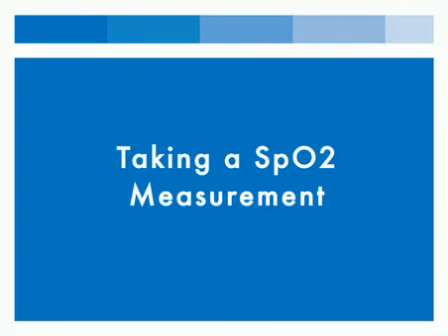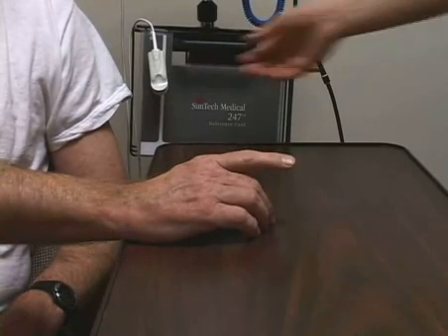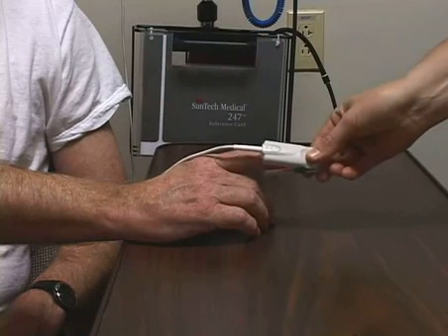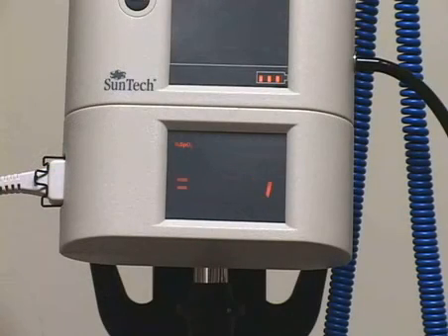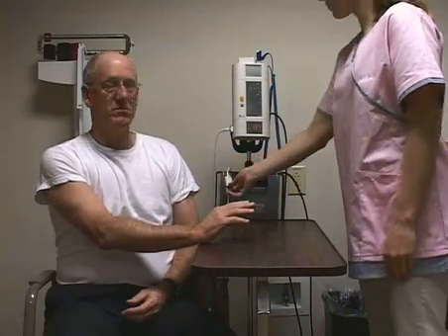To take an SpO2 measurement, start by inserting the patient's digit into the sensor. Note, there are specific sensors for children. A traveling dash will display for 10 to 20 seconds until a reading is displayed. When the reading is complete, remove the sensor and return it to the unit.